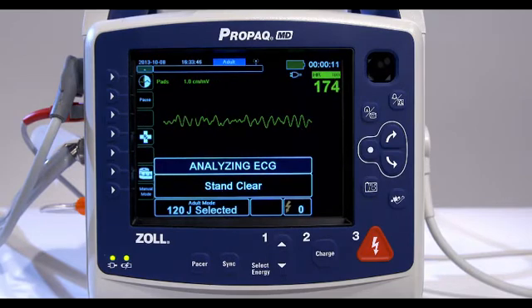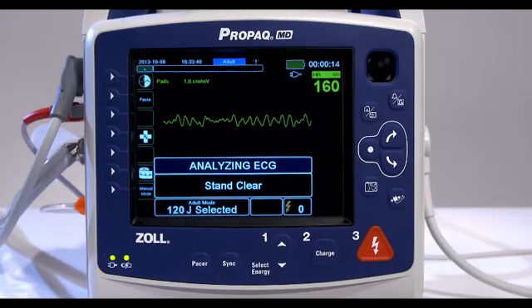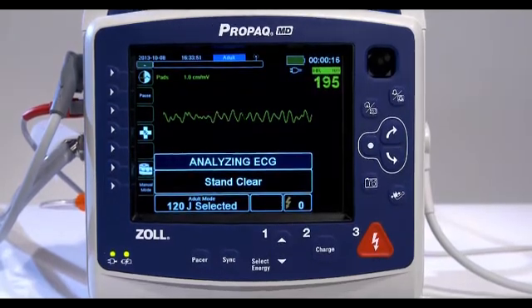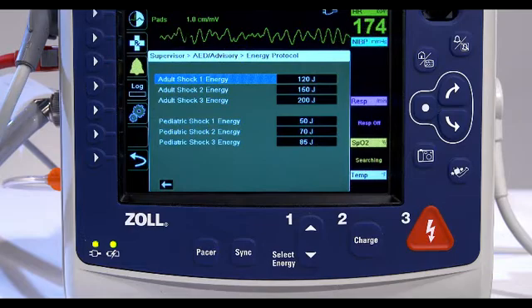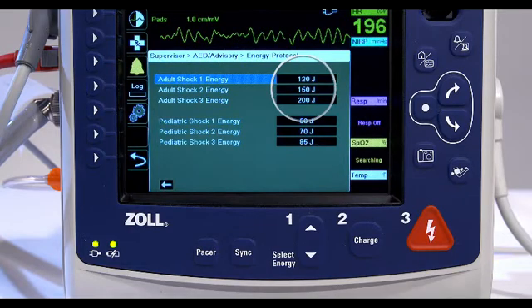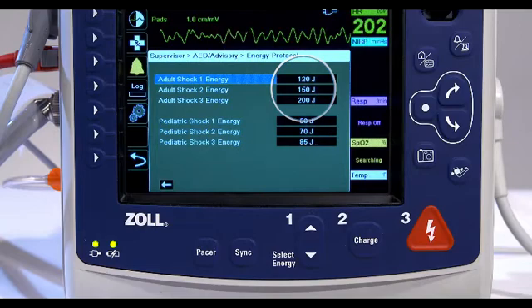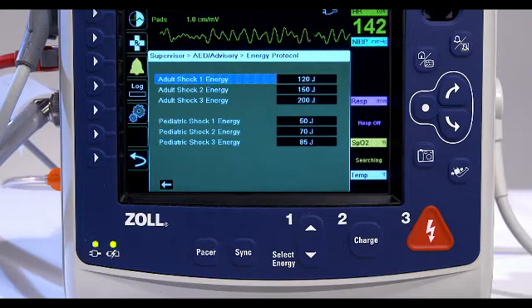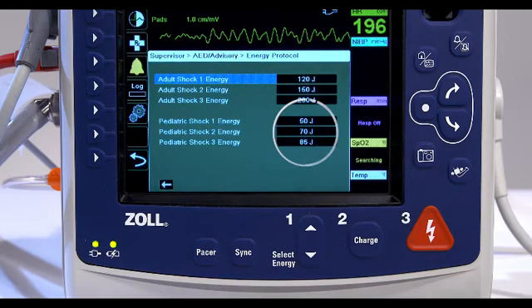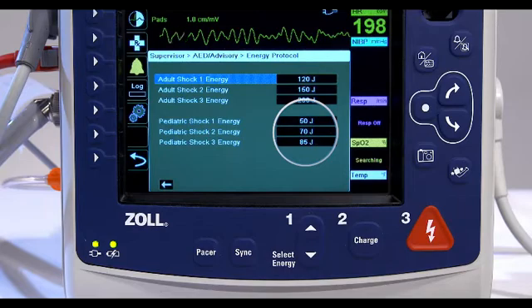Once the analysis is completed, the unit indicates whether or not a shock is advised. The default energy selections for adult patients are 120 joules, 150 joules, and 200 joules. The default energy selections for pediatric patients are 50 joules, 70 joules, and 85 joules.